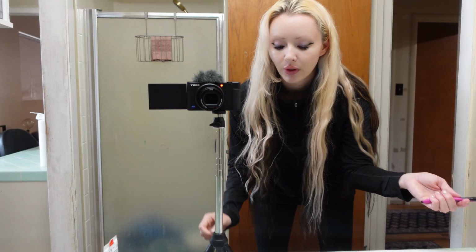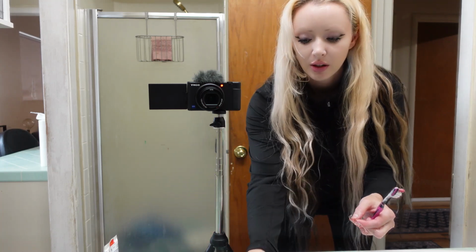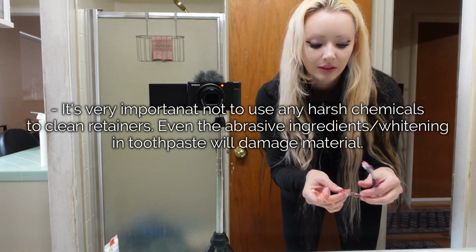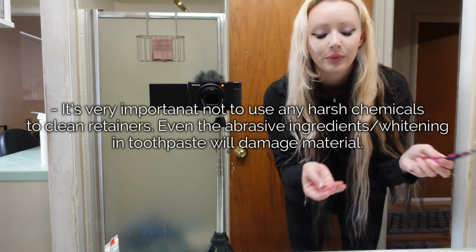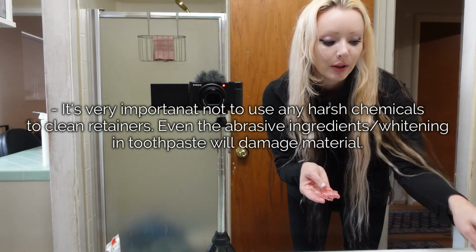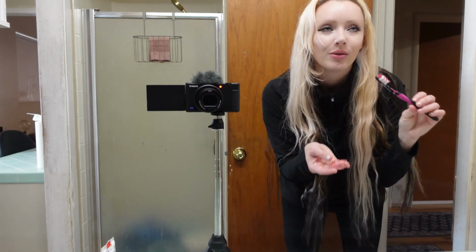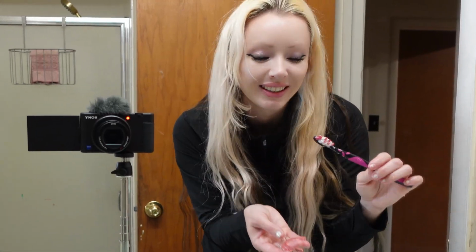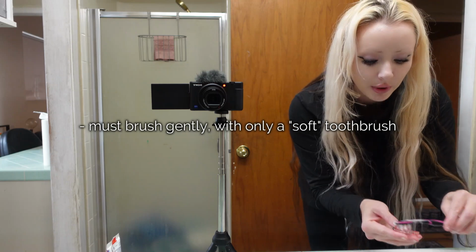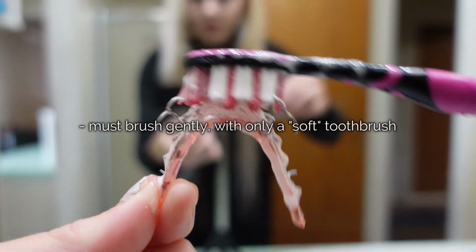Then what I do is, you're not supposed to use toothpaste on it. Well, this is not whitening toothpaste, this is children's toothpaste. Instead of putting toothpaste on it and then cleaning it, I leave whatever's watered down from just brushing my teeth, and I use that, and I go very gently, and this is a very light toothbrush. Barely putting any pressure at all on it.